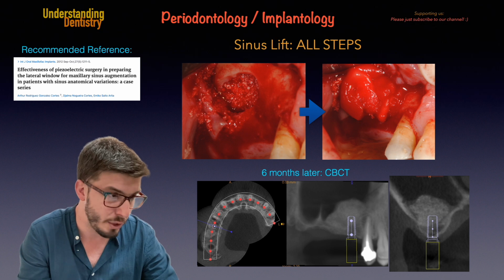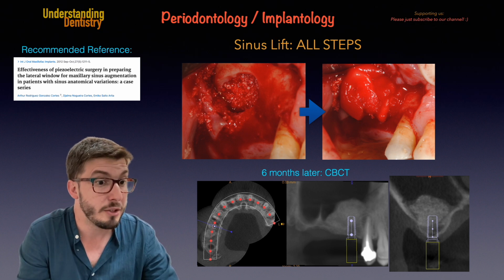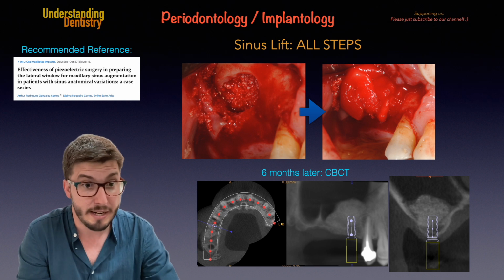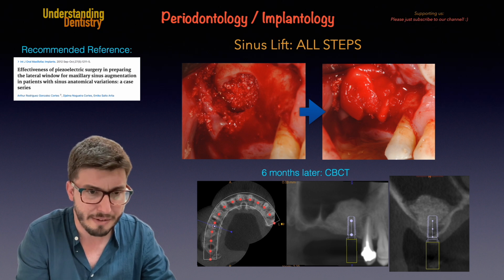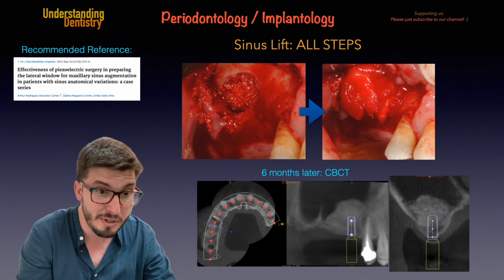Okay, that's actually allowing you to do it in 3 dimensions, and always when we need 3D information, all radiation guidelines will allow us to use the CBCT, because that's better for the patient. So for implant planning, for example, you guys are seeing the implant planning. We are seeing that the graft was stable, the graft is in good condition, and now from left to right you have the axial window.